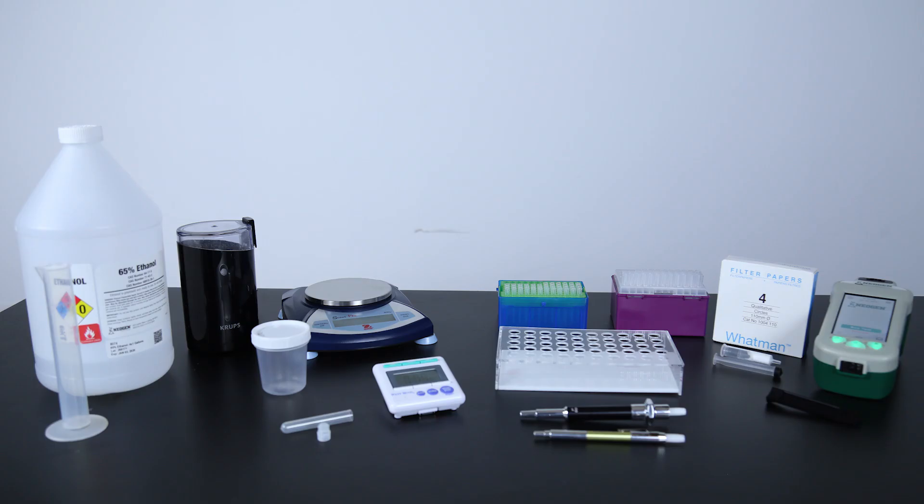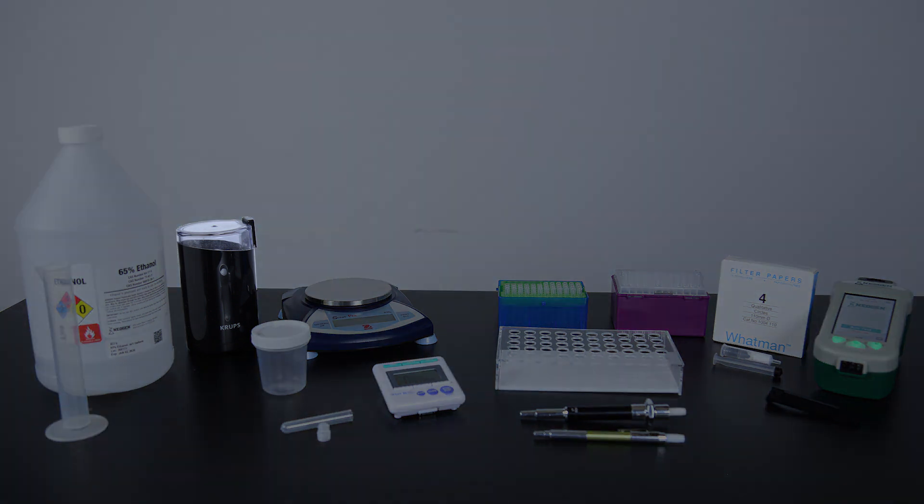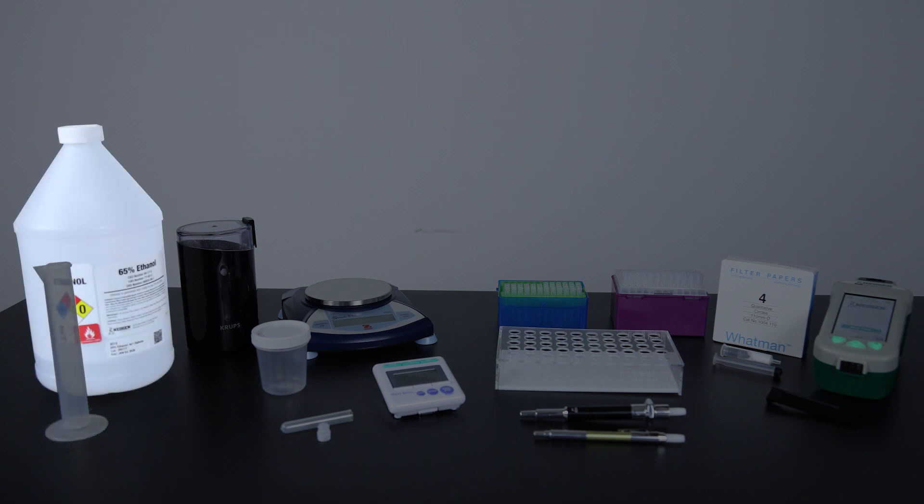To conduct the test, you will also need an Agri-Grind or equivalent grinder, a scale capable of weighing 10 grams accurate plus or minus 0.1 gram, a timer, a Reveal sample cup rack, and a 50 milliliter graduated cylinder.